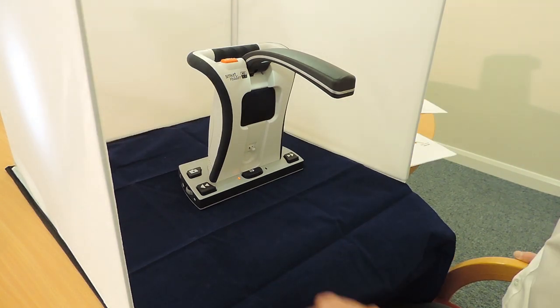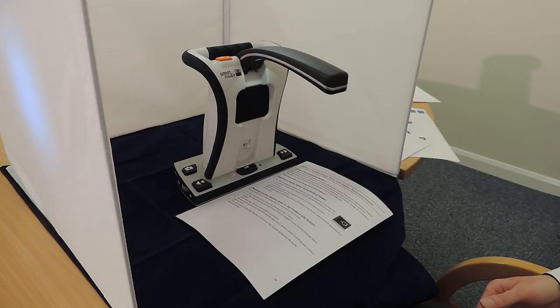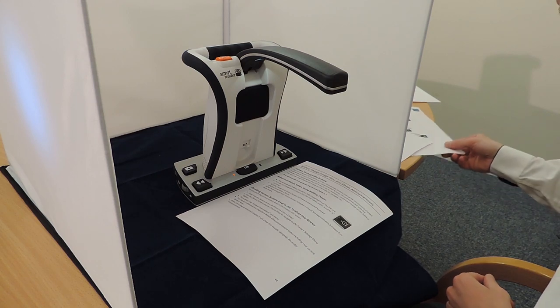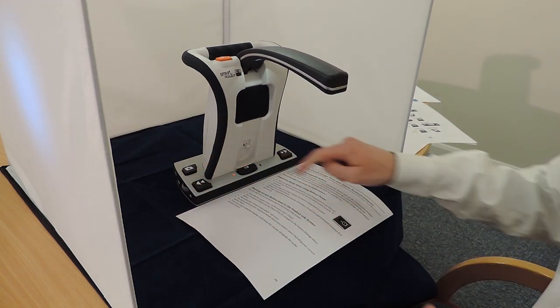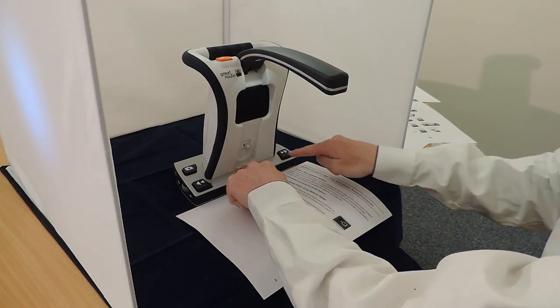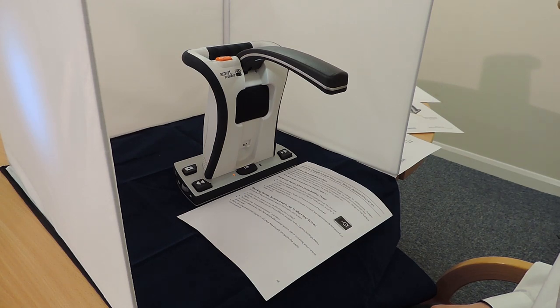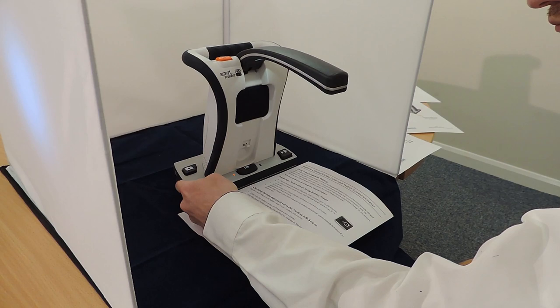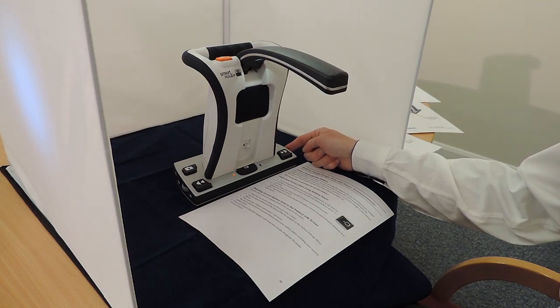We can press the OCR button again to return to home, ready to scan the next page. Note that this time I have placed the document landscape, but the Smart Reader HD has been able to self-orientate. In addition to moving to the next or the previous line, we can also go to the next or previous word by pressing and holding the play/pause button, then pressing the previous or next button respectively. On the base of the unit there is a thumb wheel on each side: on the left side there's a volume wheel — rotate this to adjust the volume. On the right side there's a thumb wheel to adjust the OCR reading speed, so if the reading is too slow or too fast you can adjust it to your liking.